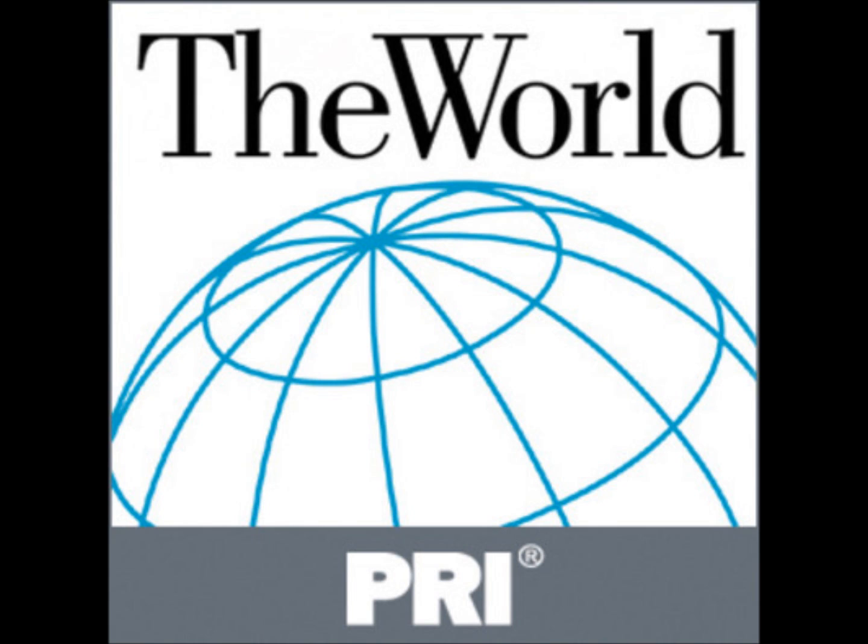Balasandram Lavan is the founder of Pace4Life. We're taking consent forms. We're getting patients or family members to donate these simple little devices. Take them, test them. If they're fit for human reuse with 70% battery life or more, we are getting them re-sterilized and then looking to get them implanted in the developing world.